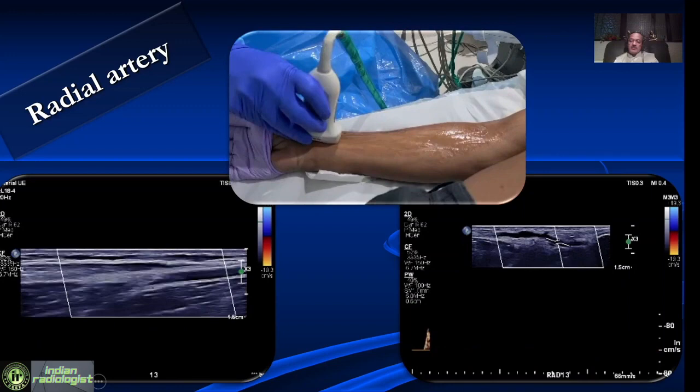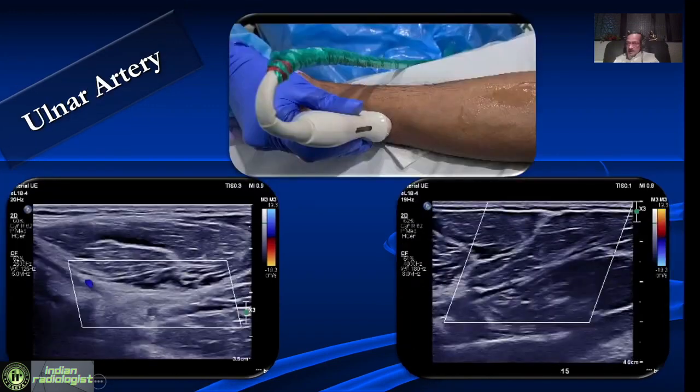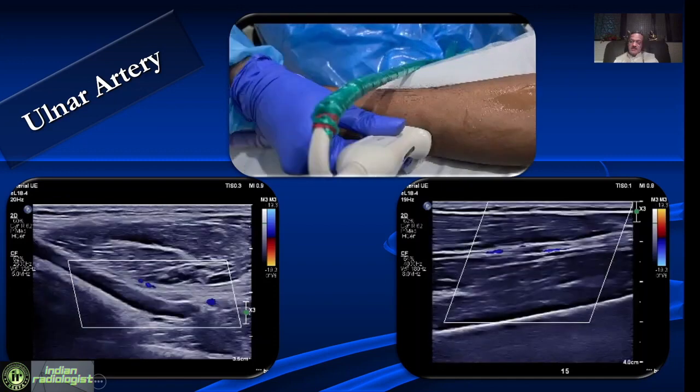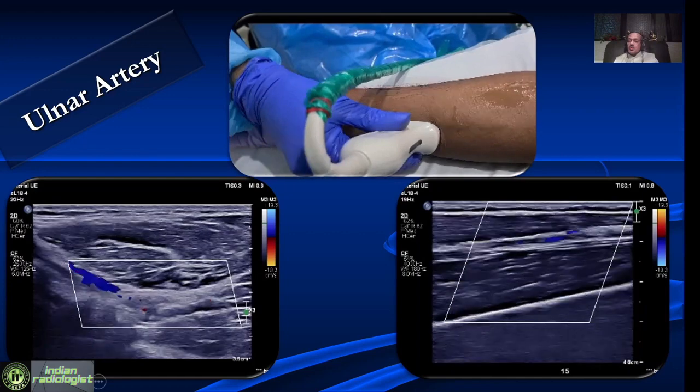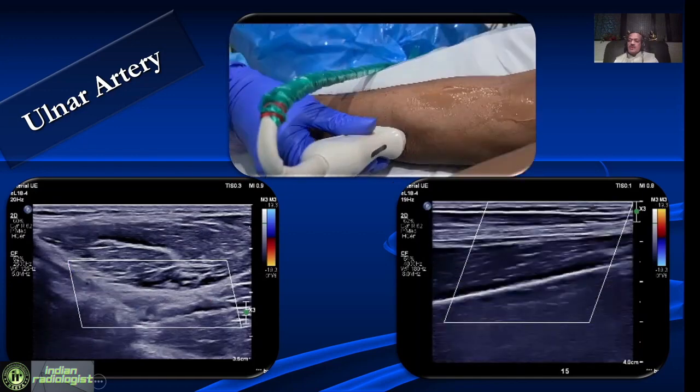Then we look at the ulnar artery. The ulnar artery dips down at its origin and the mid portion is very often difficult to see. But once you come closer to the wrist, the ulnar artery becomes superficial and again becomes easy to evaluate.